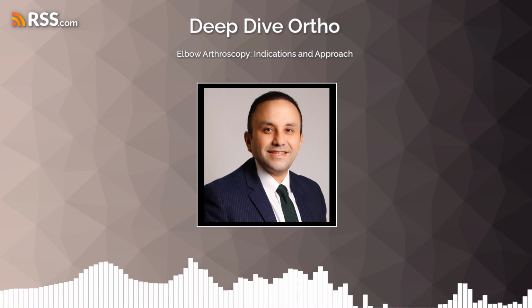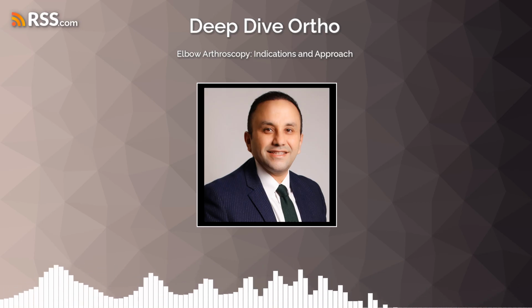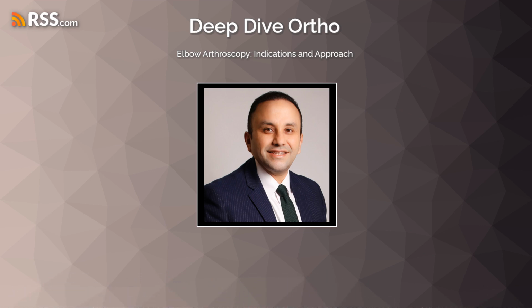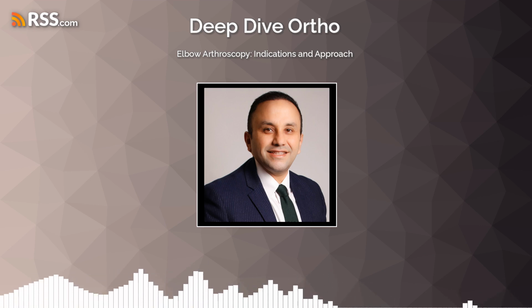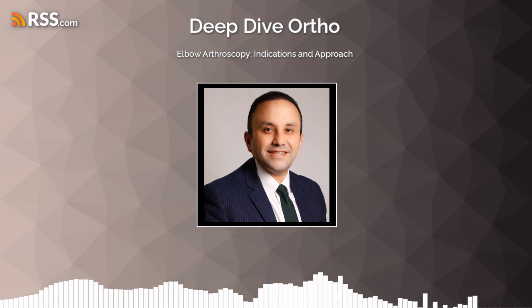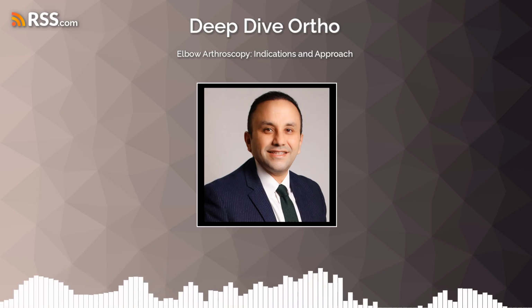A small 3-centimeter longitudinal incision is made between the medial epicondyle and olecranon with careful blunt dissection down to the cubital retinaculum. A small fenestration is then made in the retinaculum, and a specialized device, such as certain endoscopic carpal tunnel devices adapted for the elbow, is introduced adjacent to the nerve under direct vision.